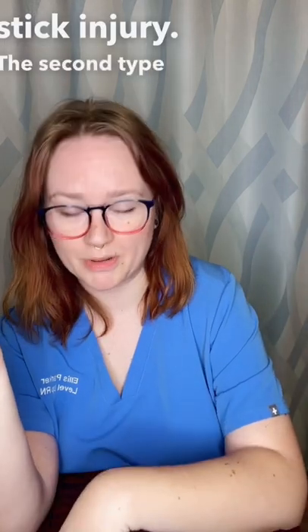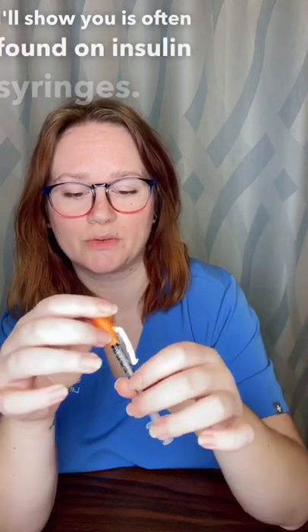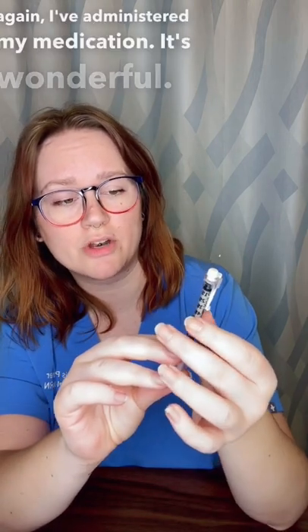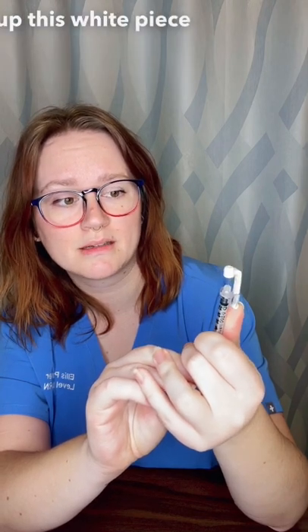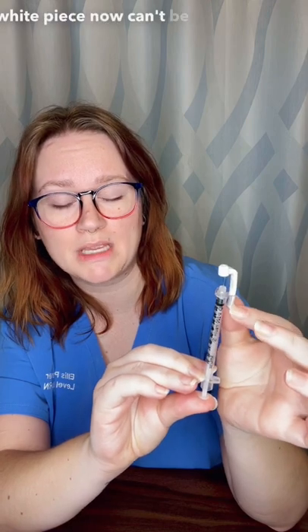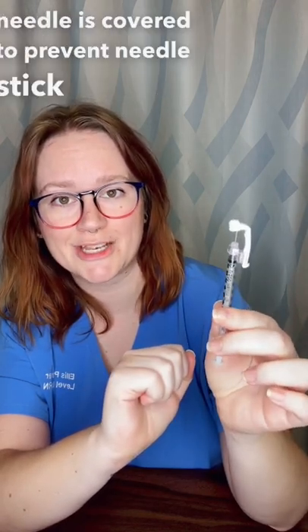The second type of safety feature I'll show you is often found on insulin syringes. So again, I've administered my medication. I'm now going to take my thumb and slide up this white piece, and it locks onto that — so the white piece now can't be pulled back down and the needle is covered to prevent needle stick injuries.